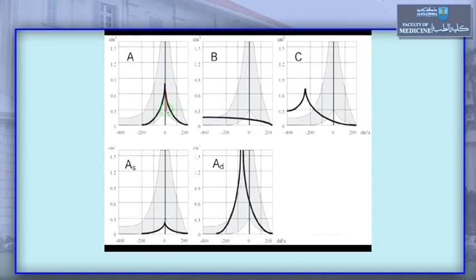The peak of the curve is opposite 0, so that's 0 pressure inside the middle ear, which means that it's normal pressure, it's atmospheric pressure. And the compliance, which is the height of the curve, we can see here is about 0.7 or 0.8 cc. That's normal, that's inside the range of the normal. So type A tympanogram is normal for compliance and normal for pressure.